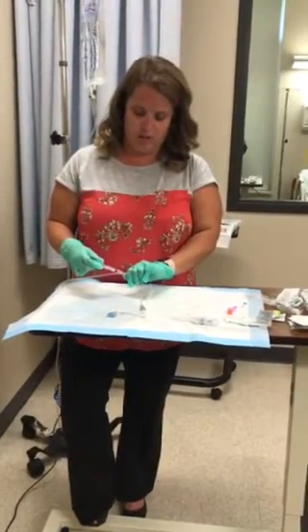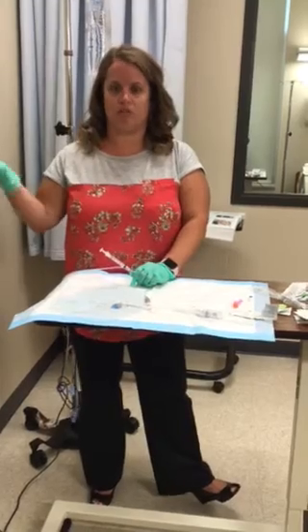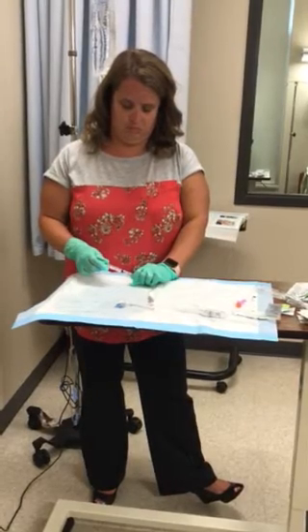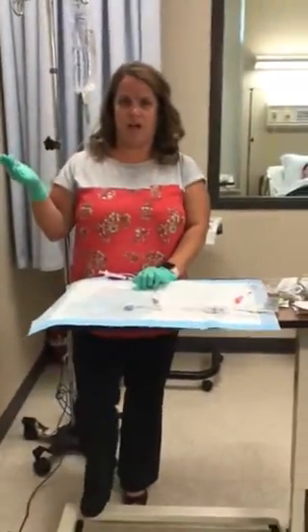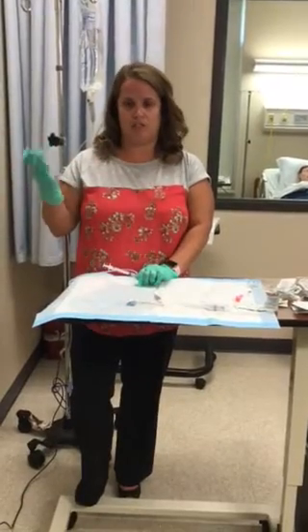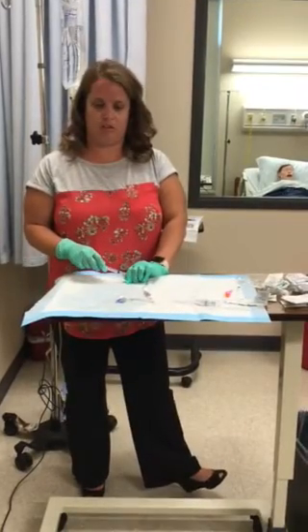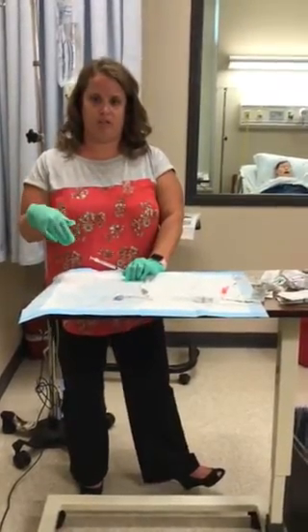Remember to do that. Now, if you're talking to the patient and you forget to push in your 15-second intervals and it's been 20 seconds, that's okay — you're not going to hurt the patient. The problem is when you push medications too fast; you could hurt and possibly kill the patient. I'm making you experience the whole two minutes because two minutes really is a long time — longer than you think. When you do IV push medications, you do have to have an instructor with you, so you can't give IV medications alone. Always wait for them.